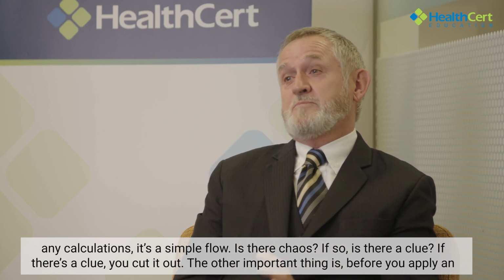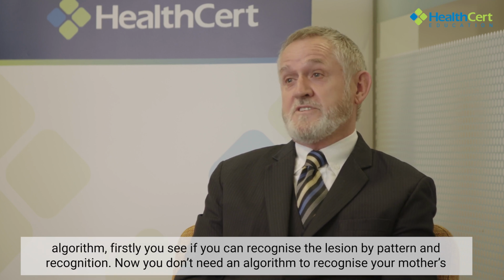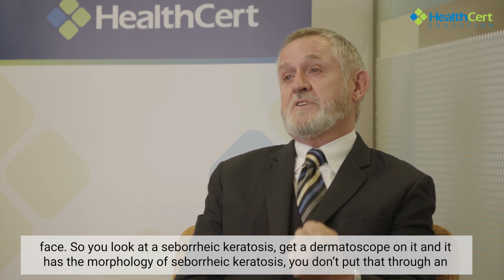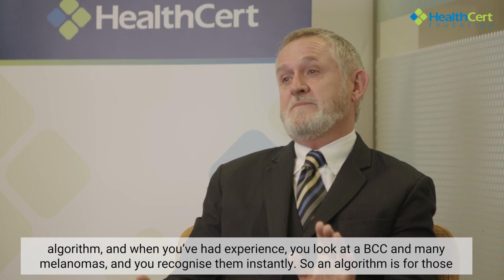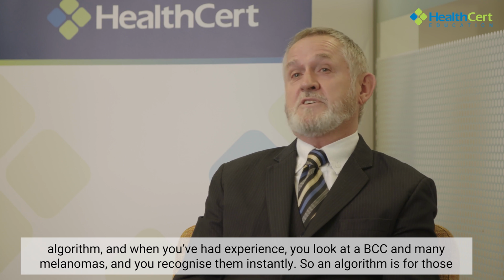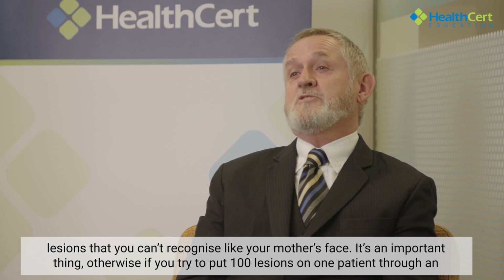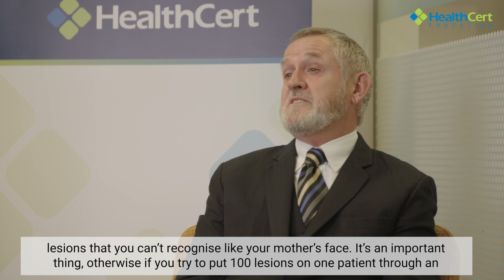And the other important thing is, before you apply an algorithm, firstly, you see if you can recognise the lesion by pattern recognition. Now, you don't need an algorithm to recognise your mother's face, okay? So you look at a SEB-K, your dermatoscope on it, and it has the morphology of seborrheic keratosis. You don't put that through an algorithm, okay? And when you've had experience, you look at a BCC and many melanomas, and you recognise them instantly. So an algorithm is for those lesions that you can't recognise, like your mother's face, okay? And it's an important thing.